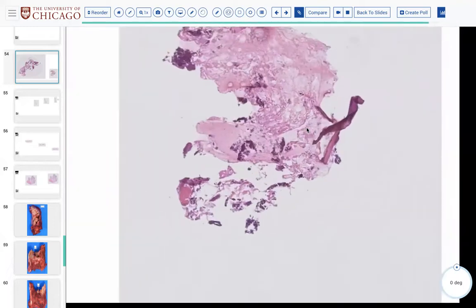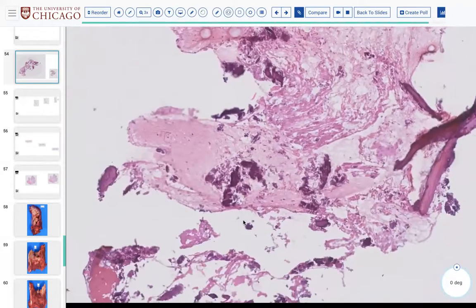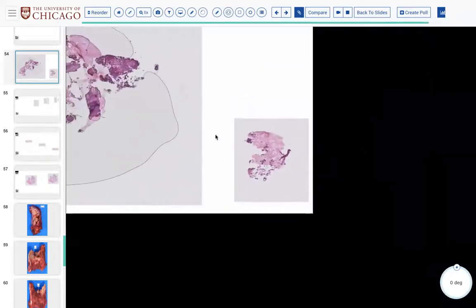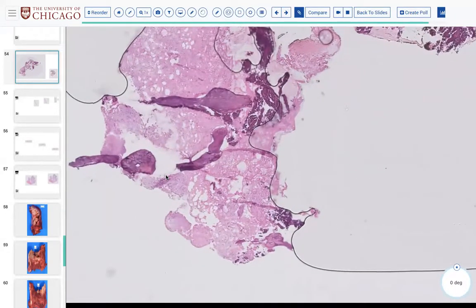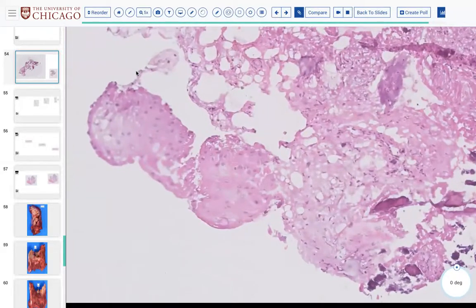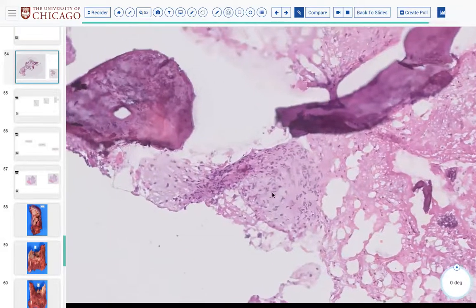I agree with that. So that's the problem sometimes with these fragmented marrow margins: one, you are not expecting to see epithelium at all in these areas because they're not at this mucosal surface. They're in the bone. So seeing any amount of epithelium at all should honestly potentially clue you into something.